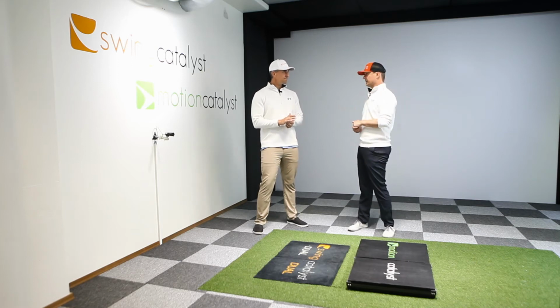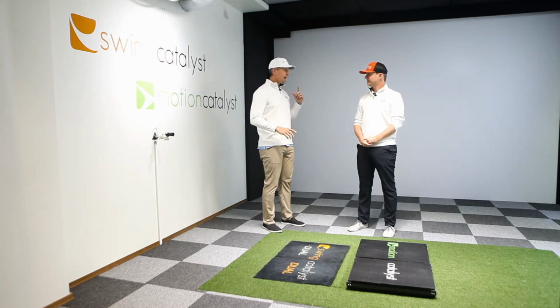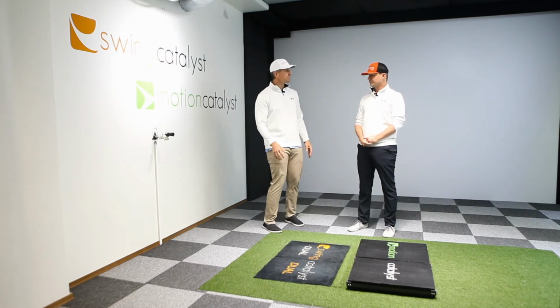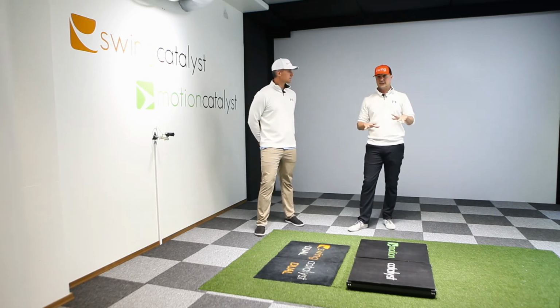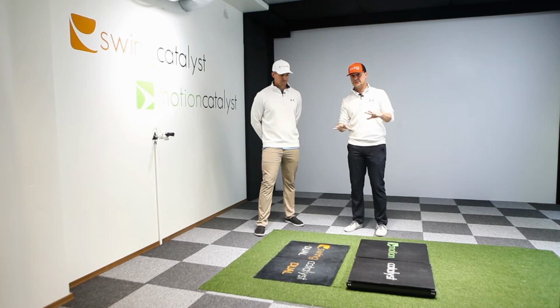You were saying even chewing gum before you collect could alter the numbers. Yep. Chewing gum, looking around from the head, oscillating the toes, moving the arms back and forth, all of that can send force into the plates and distort your body weight. And so getting a very good 0 number, or your body weight number, is going to be very important to calculate all of the key metrics that we were talking about. And so it's really important that you watch for those things.